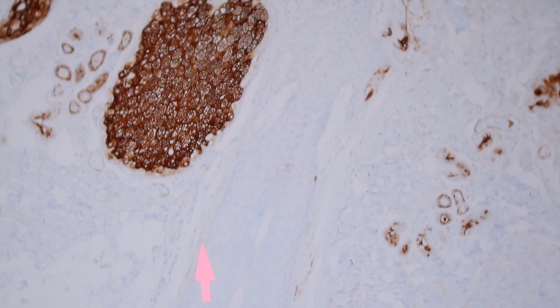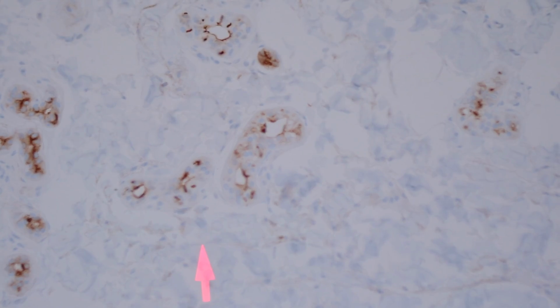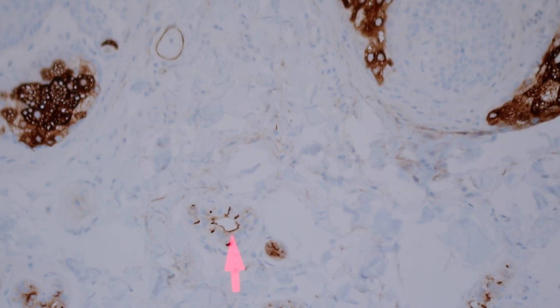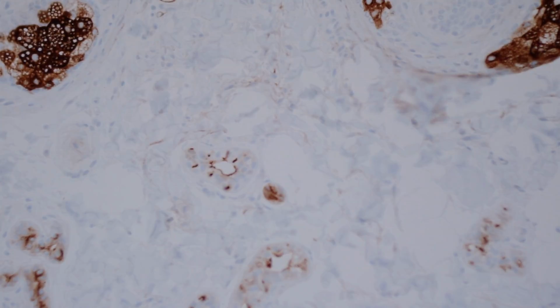Again, none of these things are perfect. CEA, carcinoembryonic antigen, can be used in a similar manner. So here's some more. This is probably even better highlighted here. You can just see beautifully the apical portion, the inner lining of the lumen of that eccrine gland right there is staining. Very pretty. So that's what EMA does in eccrine glands.